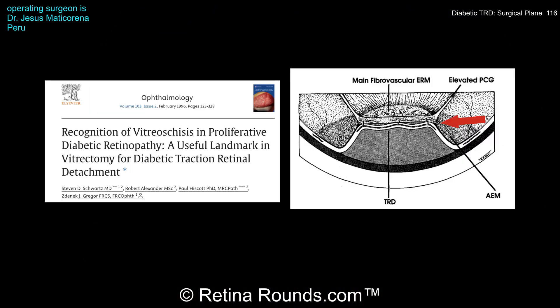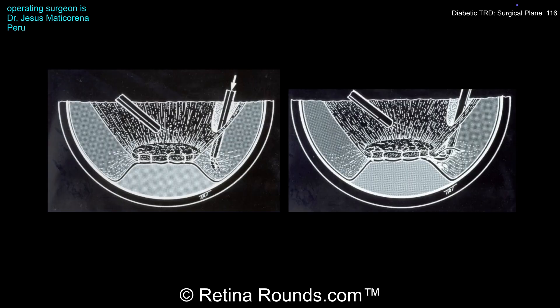The key take-home point is to find the plane between the posterior cortical vitreous and the underlying retina, as shown by the red arrow in the image. This was first described by Dr. Stephen Schwartz in his seminal 1996 publication, a must-read paper for anyone managing TRDs. The first step is to identify the posterior cortical vitreous and access the space just posterior to it. Remember, diabetic vitreous can be highly sclerotic, so don't be fooled by an additional layer still attached to the underlying retina.